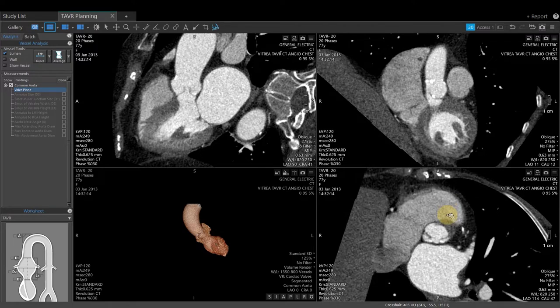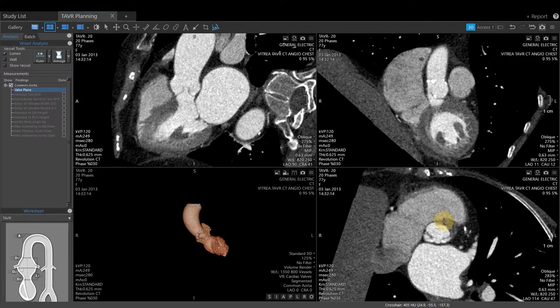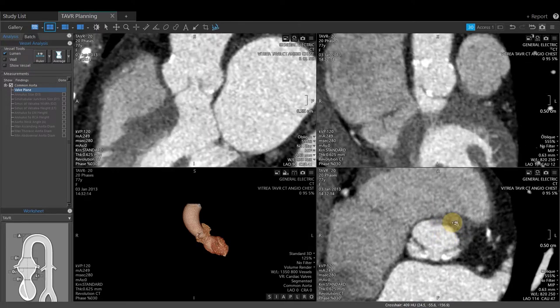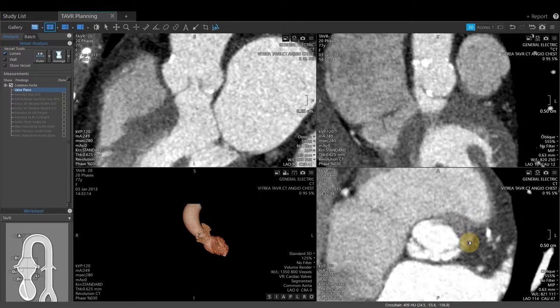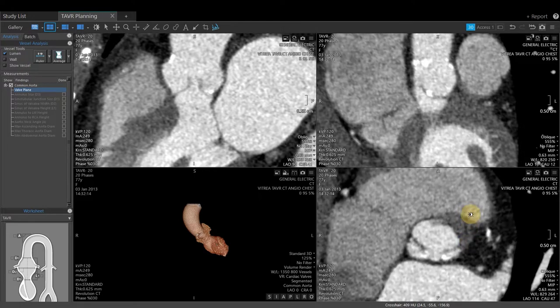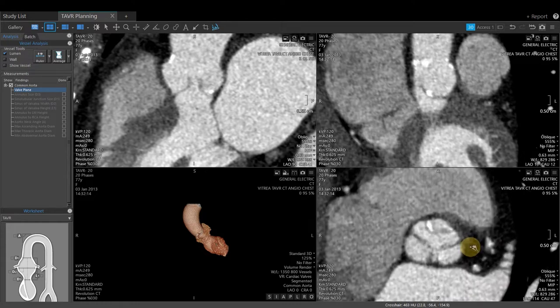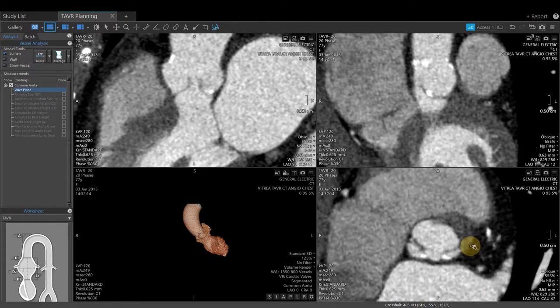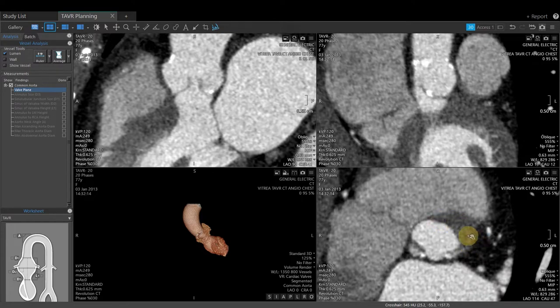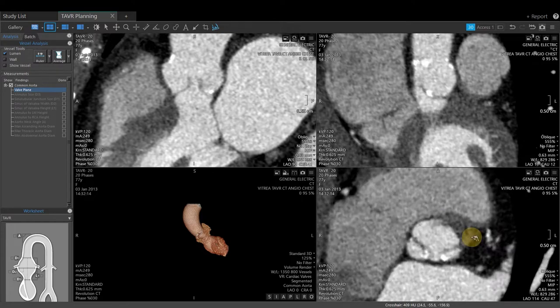To create the valve plane, use the short axis data set and zoom in by holding down the center wheel, left-clicking, and pulling the mouse towards you. Window level can be adjusted by right and left mousing together. For the valve plane, always mark the right coronary cusp nadir first. To identify the nadir, scroll up and down.